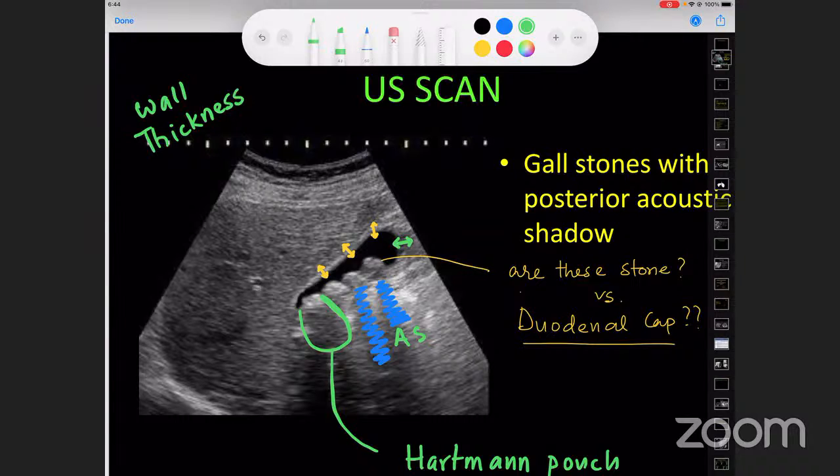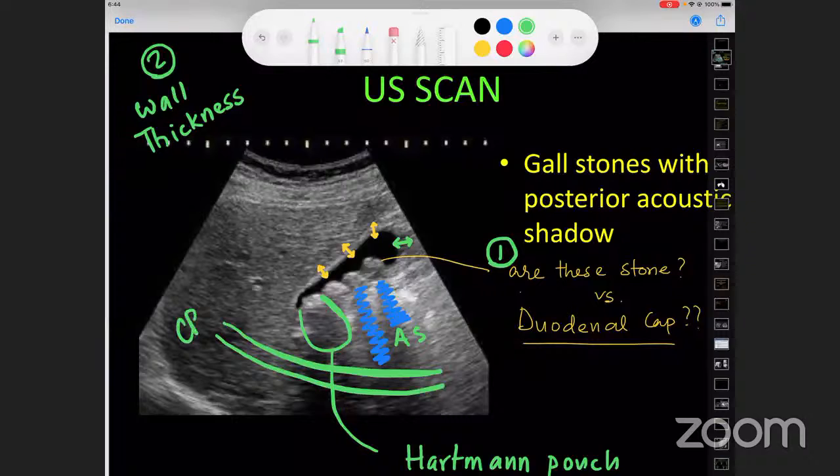The other issue that I would like to know about is the size of the bile duct. Often we find reports saying common duct normal. Now I'd like to know the size. Dr. Avik Bhattacharya, for example, always mentions the size. The important thing is that there are two tubes which go behind.